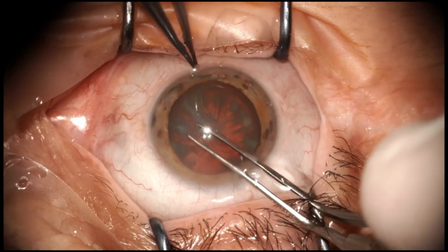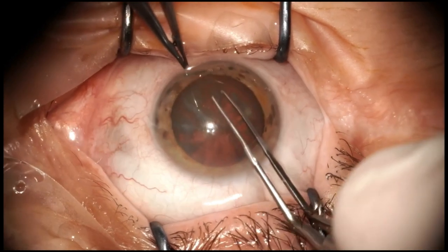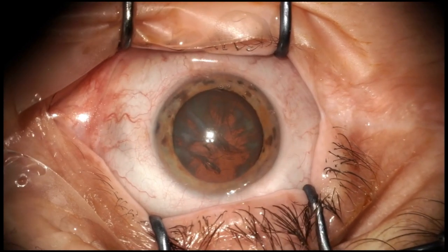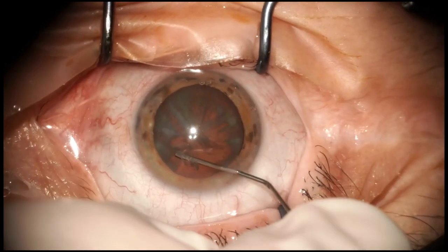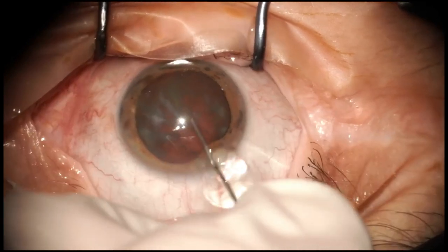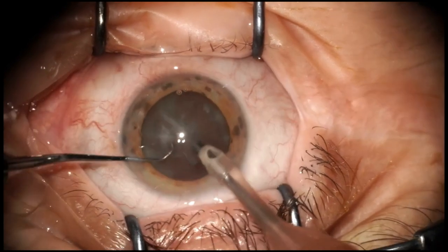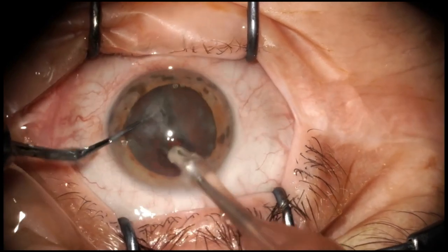And this is a regular cortical cataract. So everyday surgery. The plan is to use a monofocal single piece acrylic IOL from BVI, which is IDEA. I don't know if you know that model. And it is pretty good for hydro implantation. Now I like to do the hydrodissection through the main incision. That way viscoelastic can escape and I do not create overpressure in the AC. I'm using a balanced tip from Centurion, but on the Constellation machine.